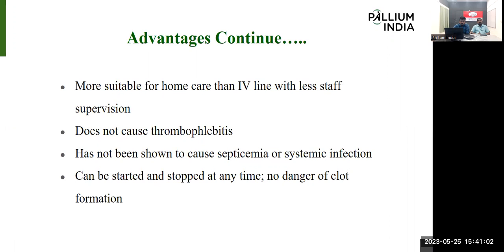Then for an IV cannula, just imagine today morning we put an IV cannula and gave one bolus injection through that cannula. There is no need to continue any medication in the daytime. Maybe another bolus injection we need to give at night time or next day morning. During this time the cannula is closed only, and maybe blood clot formation will happen, and due to that the cannula may go out. So we cannot continue with the same cannula. We need to choose another one.